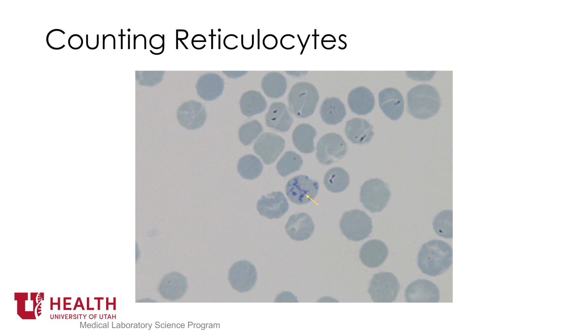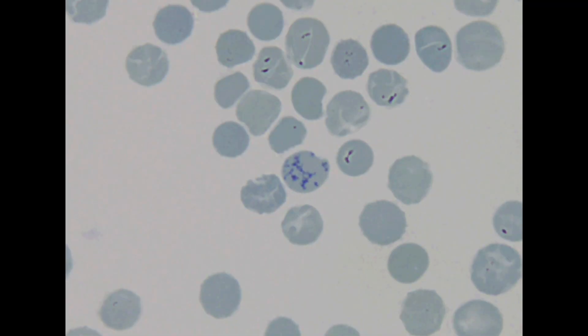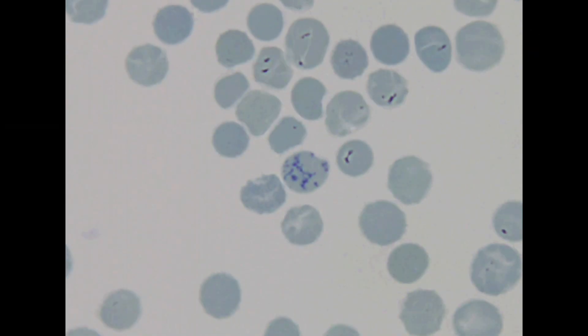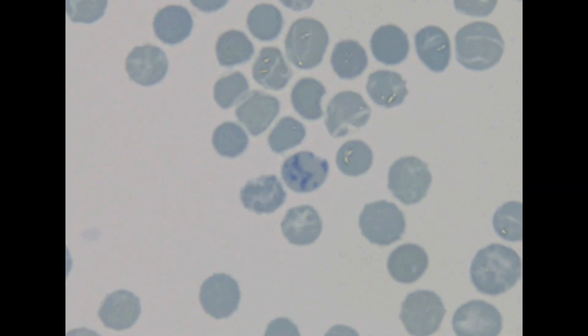If you are unsure if the cells are reticulated, focus the objective up and down. Artifacts will become refractive, but the reticulated inclusions will go in and out of focus.